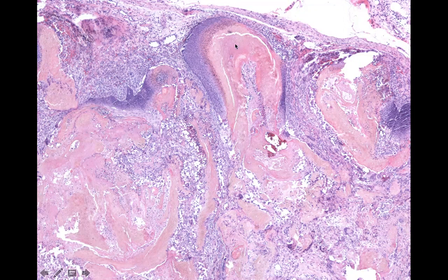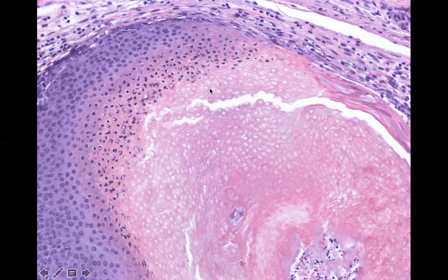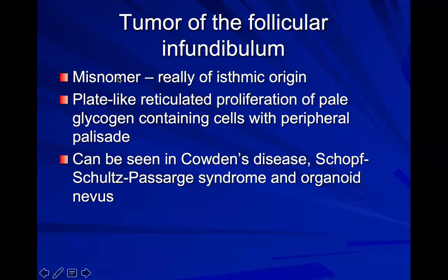And then what are these shadow cells we talk about? Well, they're just the blue cells that have died, right? This is like the equivalent of parakeratosis, and then the nucleus leaves, and then you have the dead cell. It's not actually like normal keratin the way something keratinized. See, these are the levels of development, dying, dead. But this is the tumor cell, or the cyst wall cell, okay?